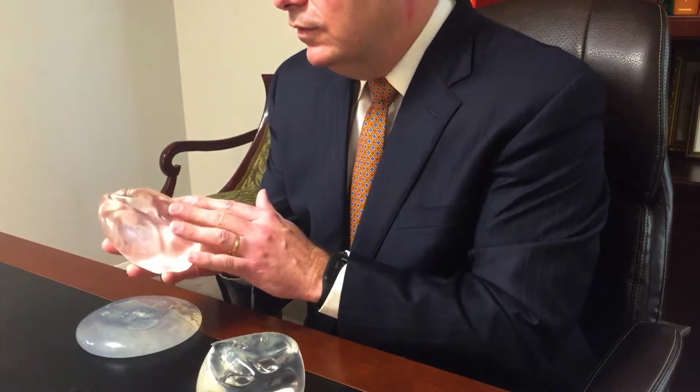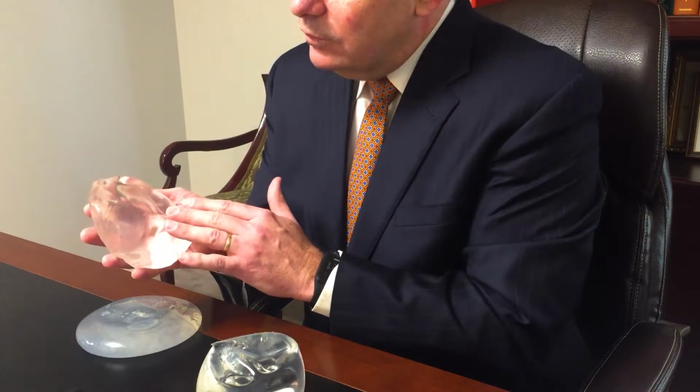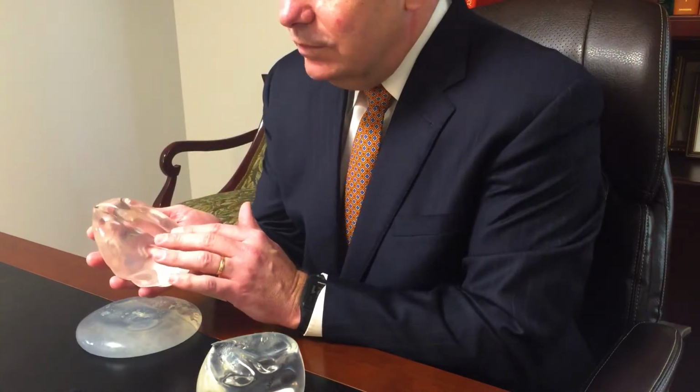On the other hand, silicone implants, which I was part of the clinical investigating team several years ago that determined that they were equally safe to saline implants, are filled with a jelly-like substance. And that jelly-like substance is not a liquid, and hence the term gummy bear implants or gummy implants. They tend to hold their shape a little bit better. They, again, are filled with a jelly-like substance, and therefore they don't tend to ripple quite as much. They hold their shape better.